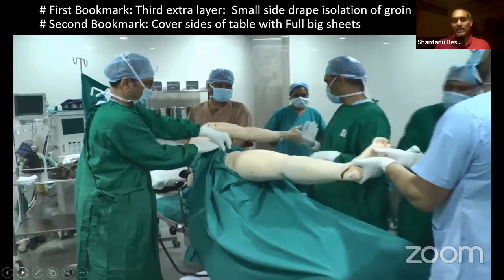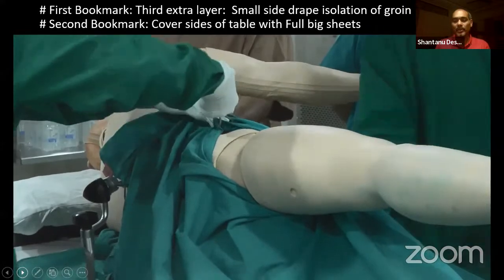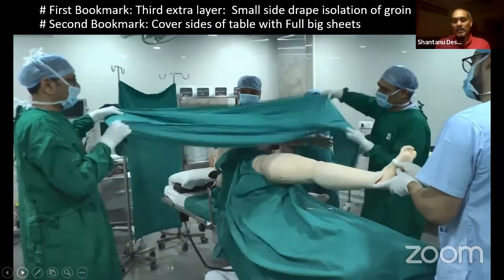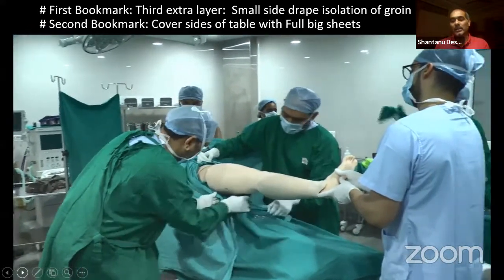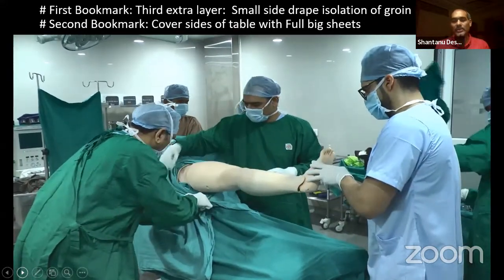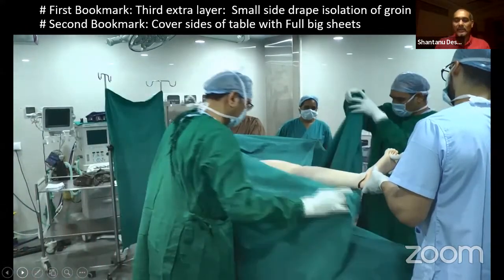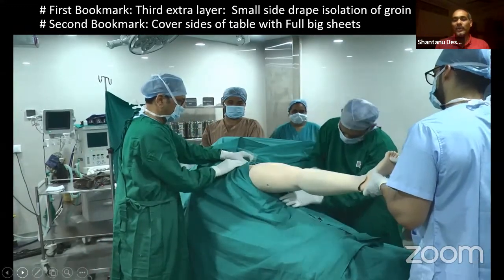The proximal ends are now taken across the groin area and held together with a clip. So this is where you are starting to isolate the groin. Now another sheet comes from the top and the two ends of the sheet are taken to the groin area, posteriorly or anteriorly, depending on what your operating incision is, making sure that it is covered on both sides. On top of this, we are taking two medium-sized drapes and they are coming from front and behind.